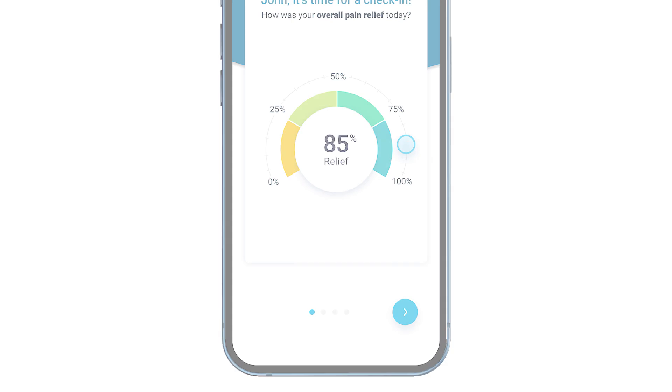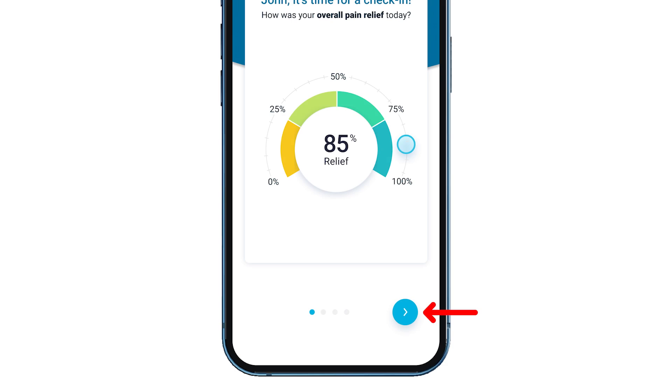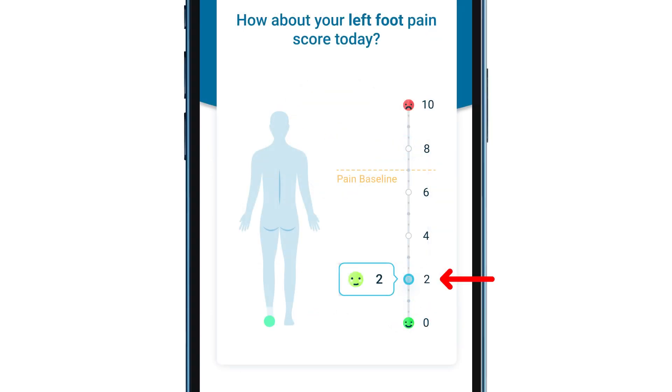To progress to the next screen, tap the arrow where you will rate your current pain score. You can select a number from 0 to 10. If you have more than one pain area, you will enter a pain score for each individual area.